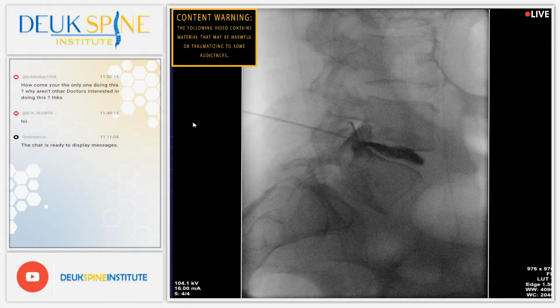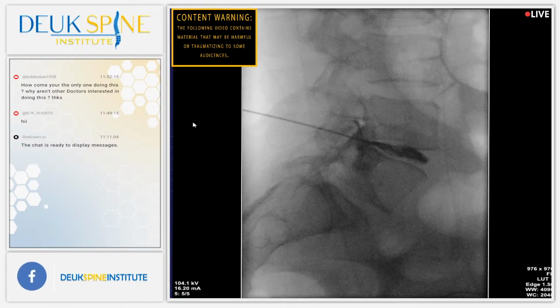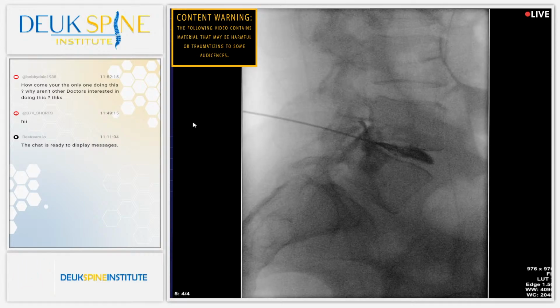Henry, let's show the audience. You got to keep the videos moving, Henry. Yes, sir. Show the audience how it is that we cure a herniated disc.